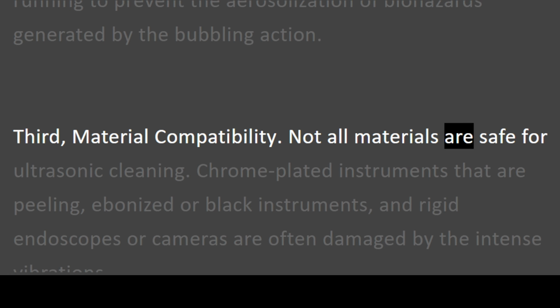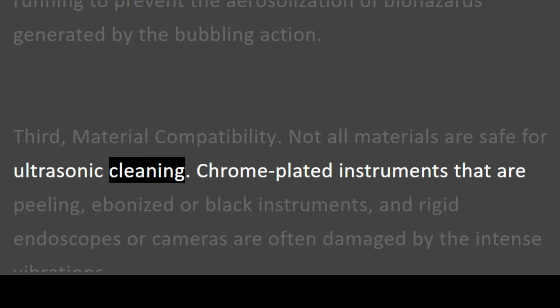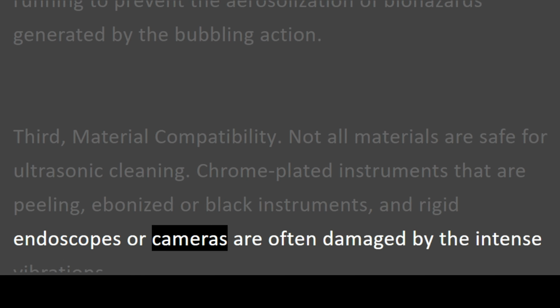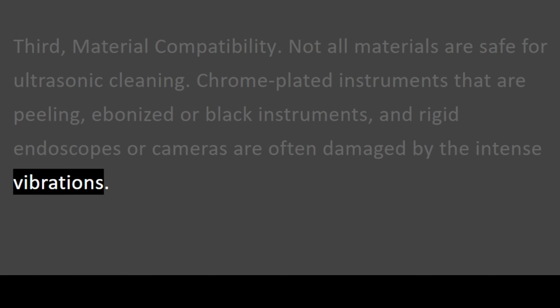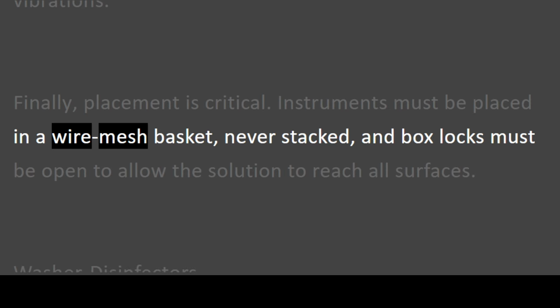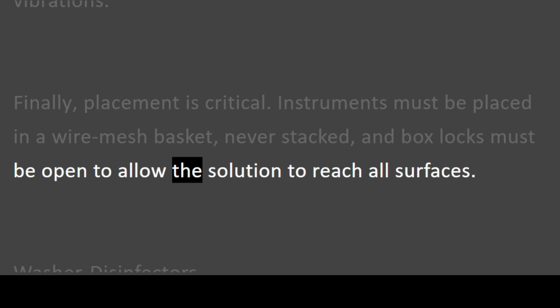Third, material compatibility. Not all materials are safe for ultrasonic cleaning. Chrome-plated instruments that are peeling, ebonized or black instruments, and rigid endoscopes or cameras are often damaged by the intense vibrations. Finally, placement is critical. Instruments must be placed in a wire mesh basket, never stacked, and box locks must be open to allow the solution to reach all surfaces.